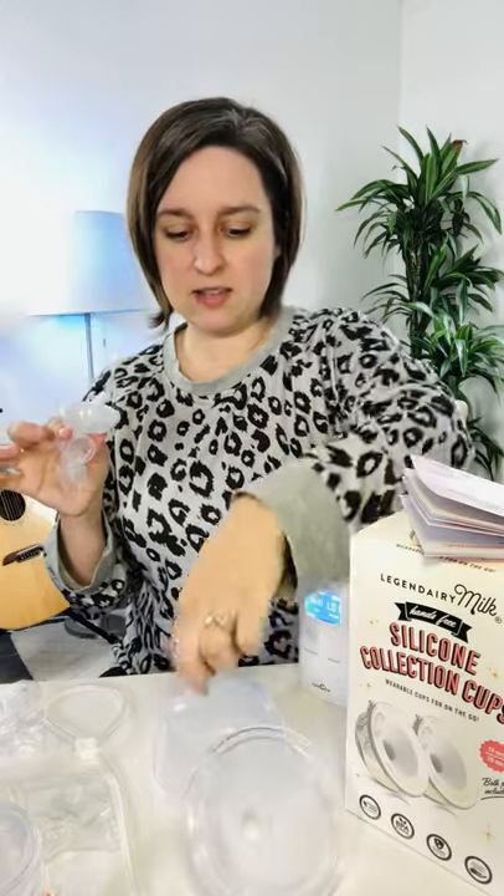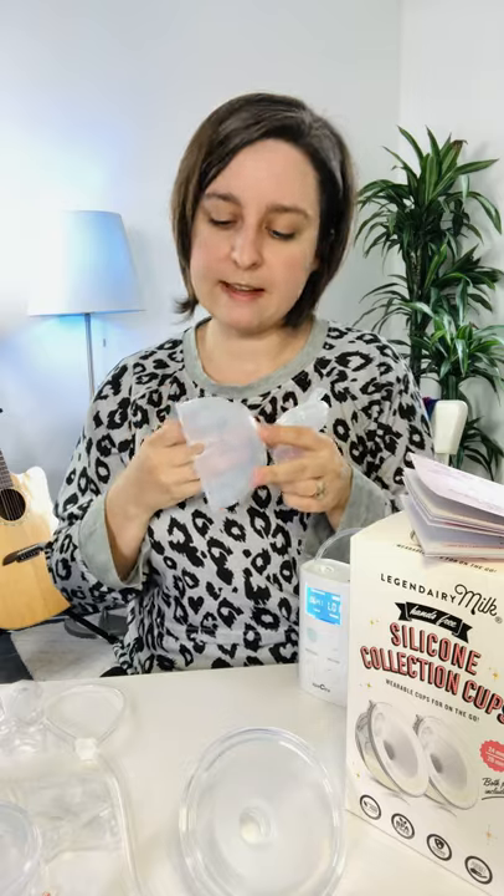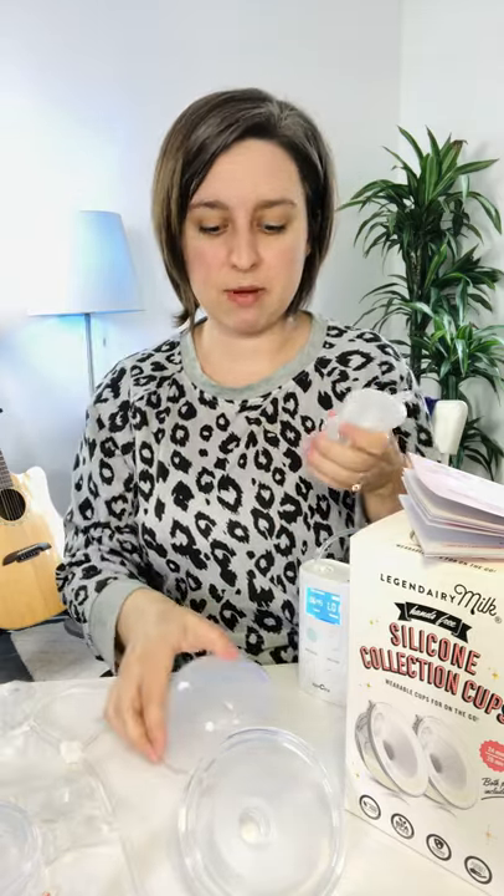Assembly is really easy. You've got the flange part and the cup. The cup holds 240 milliliters, which is 8 ounces, so that's a lot of milk. It's large, but it's much more discreet than having a bottle hanging off you. None of these pumps are really unnoticeable, but if you're pumping milk you're going to have something.